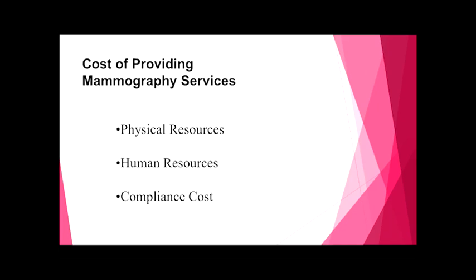There are a multitude of other things that have to be provided to be able to provide good mammography, starting with your physical resources and your equipment, and then your human resources from the time somebody walks in or schedules their procedure, to after the procedure has been done by the technologist and interpreted by the physician: the communication of the results, the medical audit, the things that have to be done.